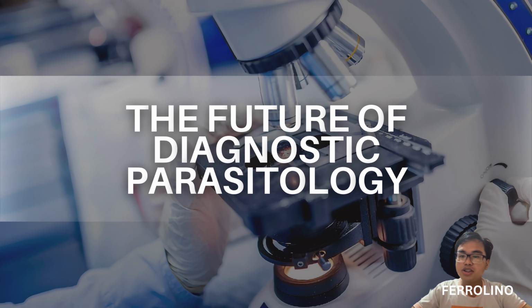As we look at the future, we must ask, are we satisfied with good enough diagnostics? The future of our field lies in the integration of the tools we have discussed: LAMP for the field, ddPCR for absolute quantification, and next-generation sequencing for host-parasite mapping. Looking at the image of the microscope in the background, it remains a vital tool for training and basic identification, but it is no longer the final word for surveillance. The future is molecular surveillance.